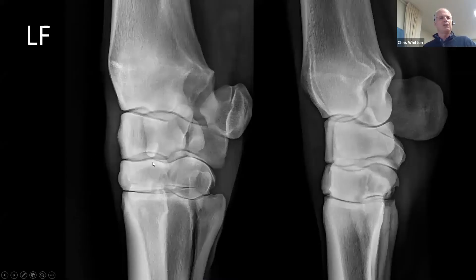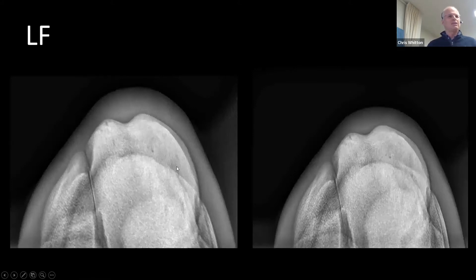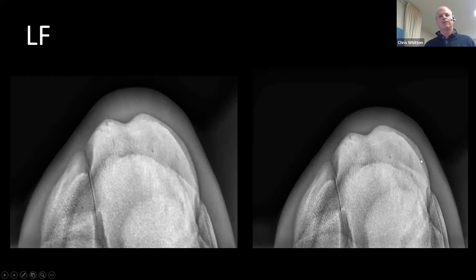Here's the oblique view and there's a little bit of modeling on the dorsal aspect of the radial carpal bone, but not much else to see there. A number of skylines were taken because there were these suspicious areas of lysis — small areas of lysis in both the radial facet and the intermediate facet of the third carpal bone.